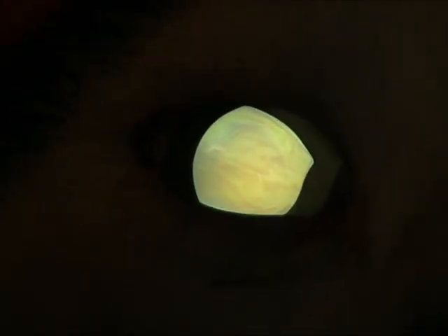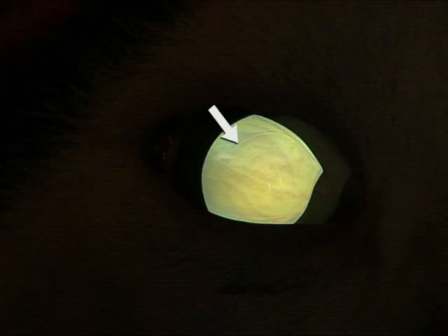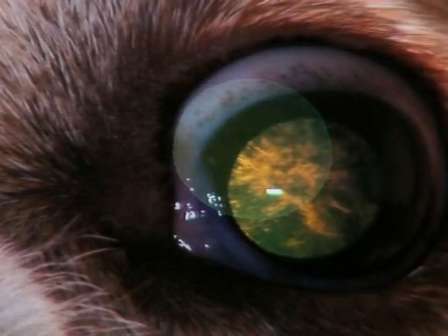Nuclear sclerosis shows up on distant direct ophthalmoscopy as a ring outlining the nucleus. Unless there is also an opacity present, the tapetal reflection is otherwise uninterrupted. Distant direct ophthalmoscopy is therefore a quick and reliable means of distinguishing between nuclear sclerosis and cataracts.